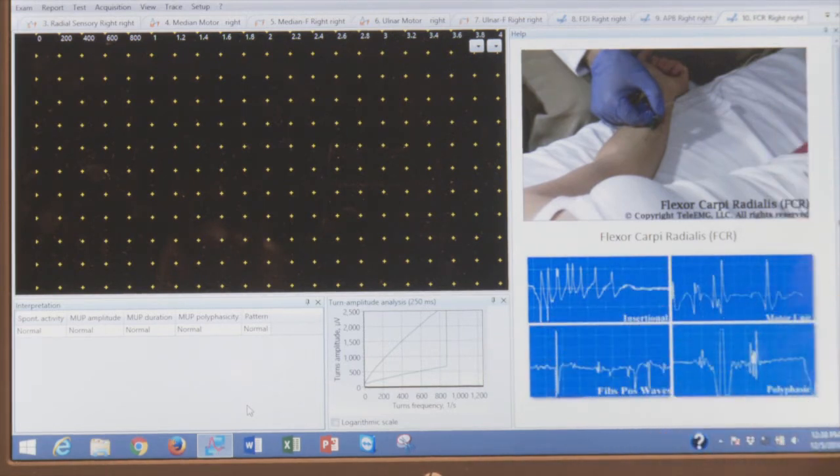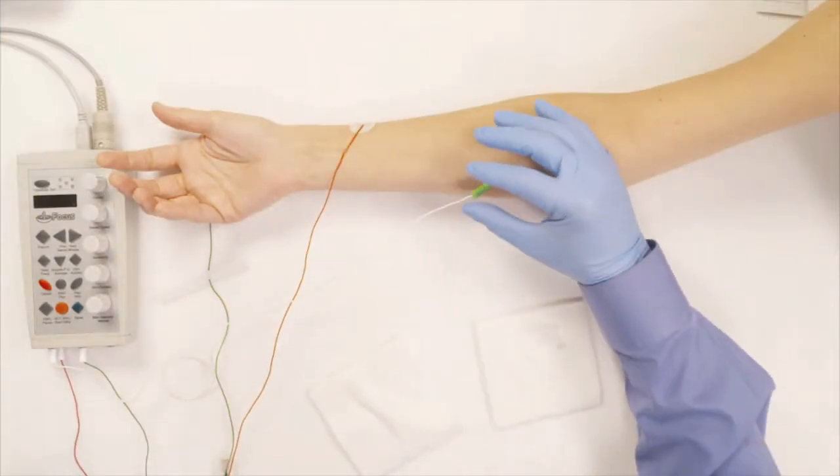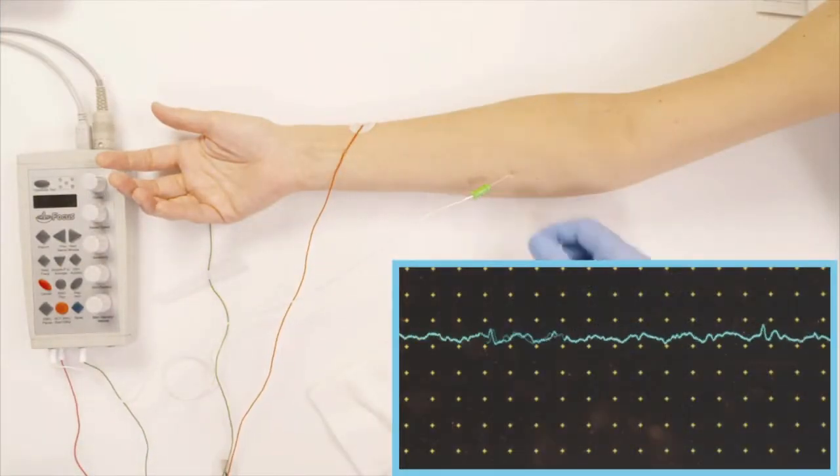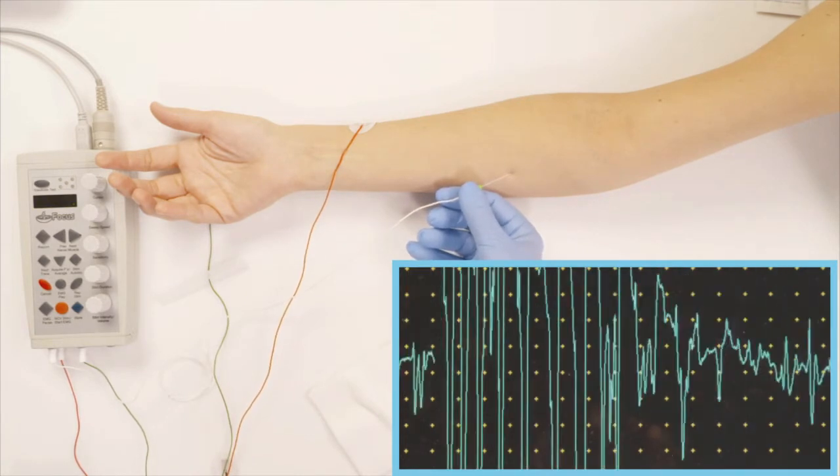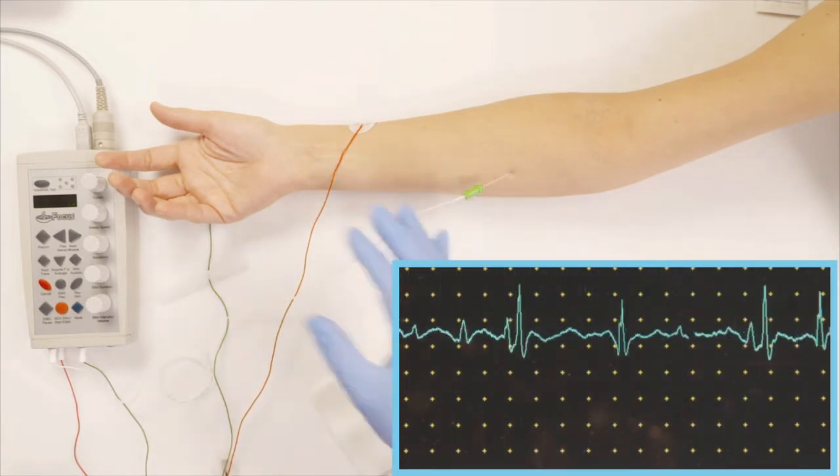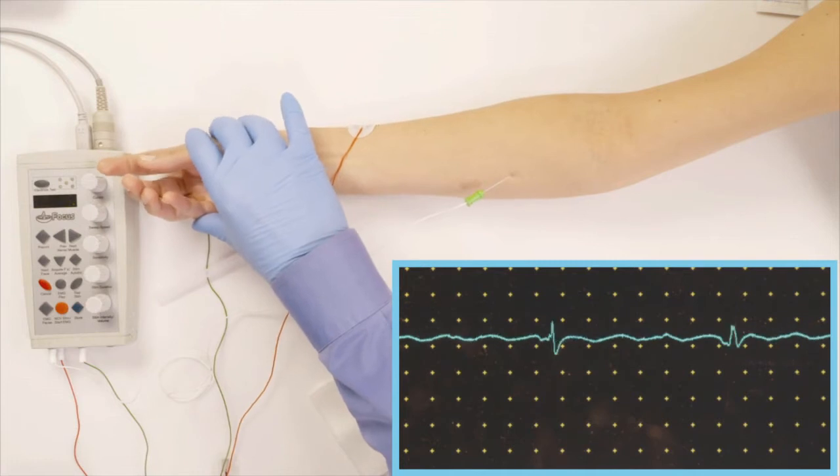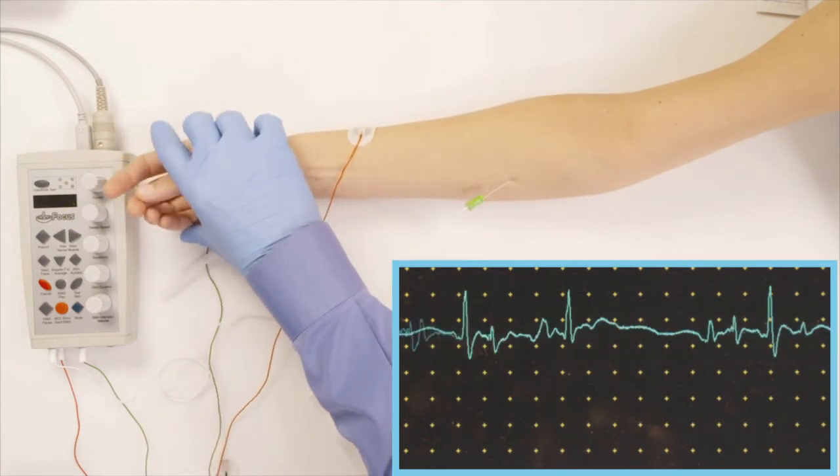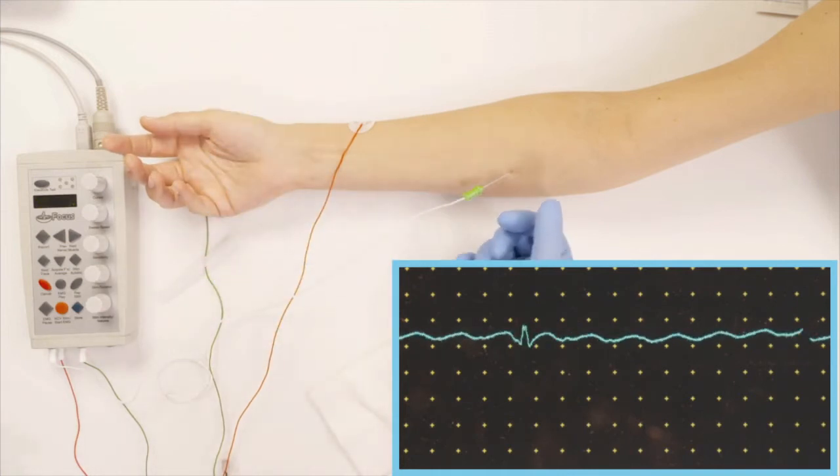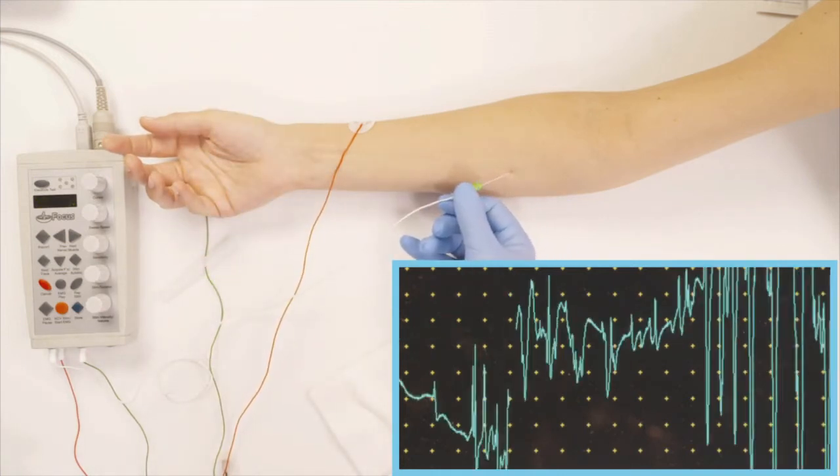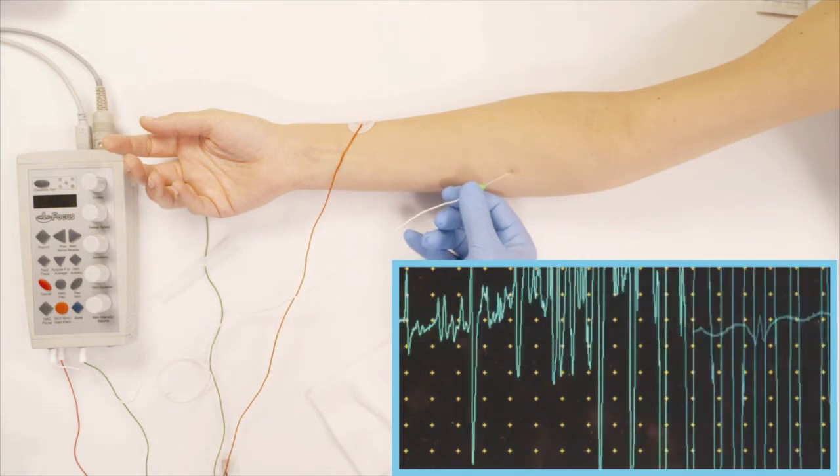Now I'm gonna start to see if I get insertional activity and I'm trying to find out if there is activity that persists. Here she's contracting a little bit. Relax a little bit more. That's perfect relaxation. You can see the spike and it must stop as soon as you stop.